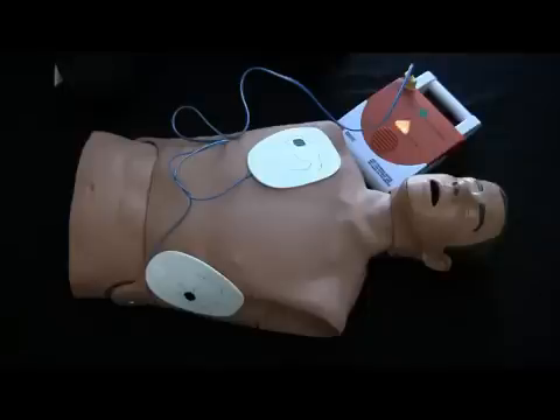Everyone stand clear. Push the shock button. Shock delivered.